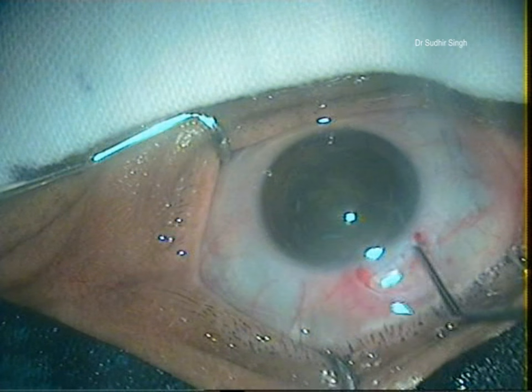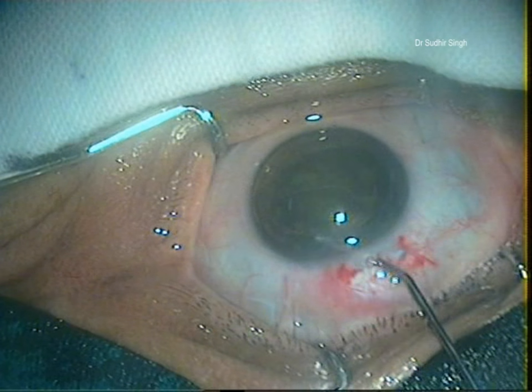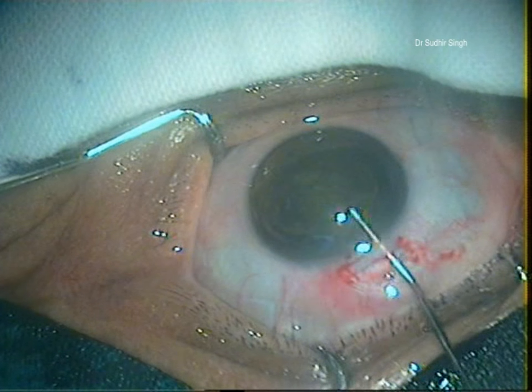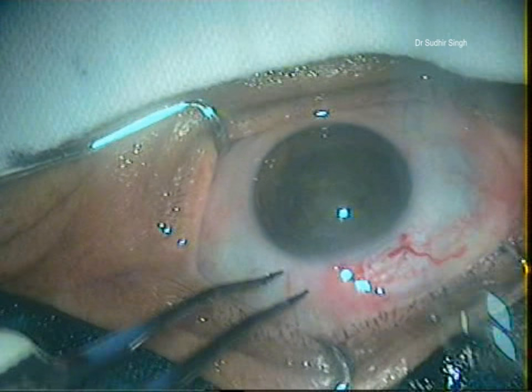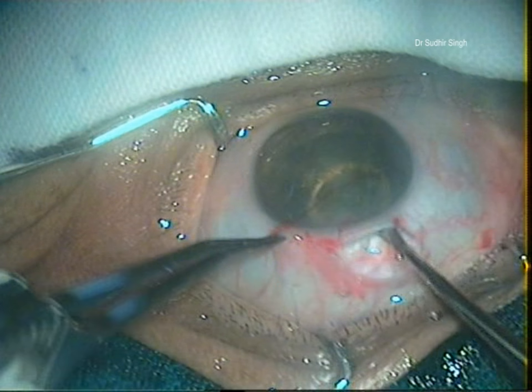The globe is stabilized with two forceps and a vectus is introduced through the tunnel and positioned between the iris and the nucleus. The nucleus is engaged in the lens loop and slowly withdrawn from the anterior chamber while the posterior lip of the tunnel is depressed.